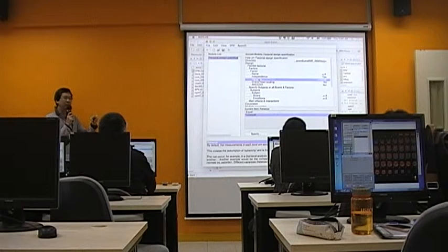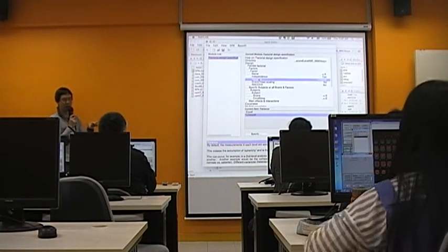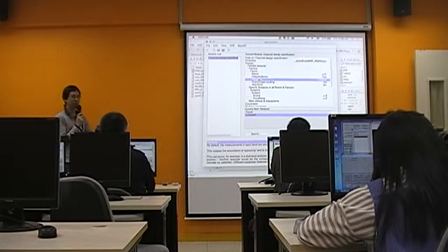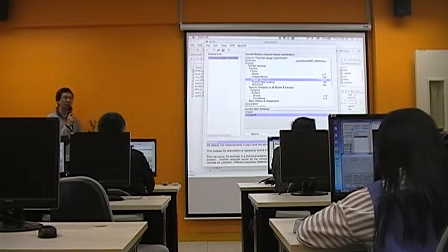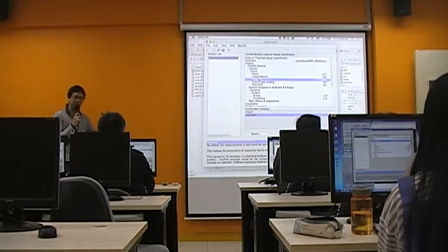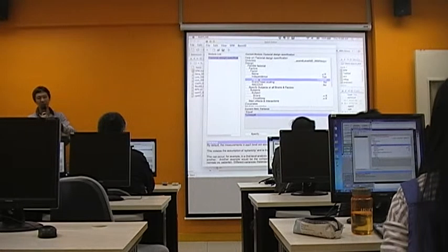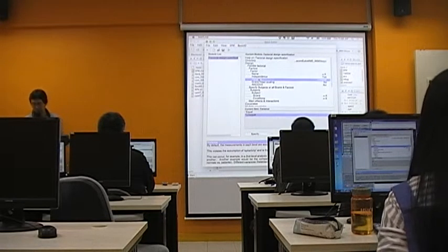So that's why it is a more sophisticated way of defining how you divide your explained variance with respect to each different factor. So in theory, using the flexible factorial design will give you a little bit more sensitivity compared to when you define your contrast, or you simply use your beta and put it to a second level one sample t-test. So that's what we call the improvement in this case.